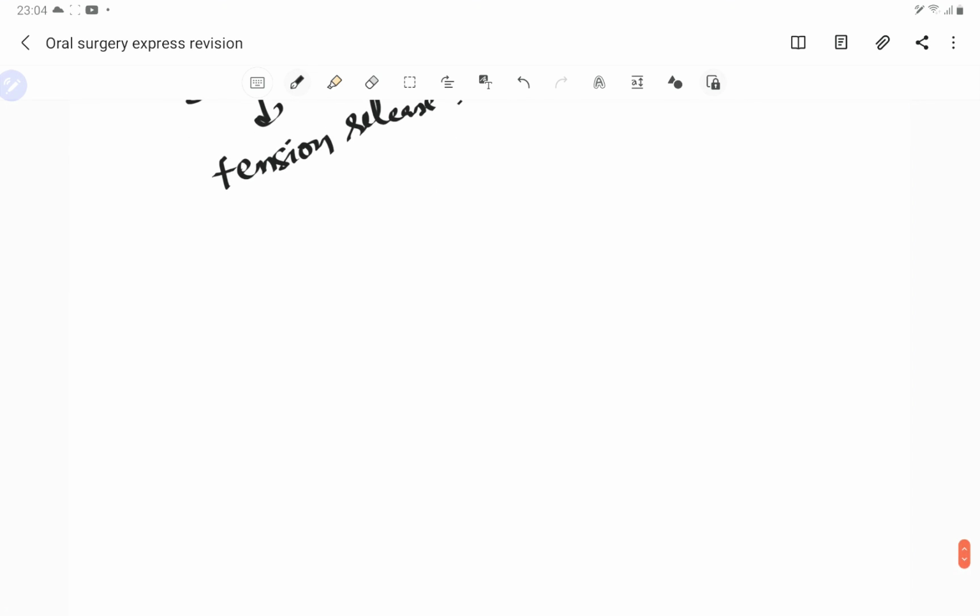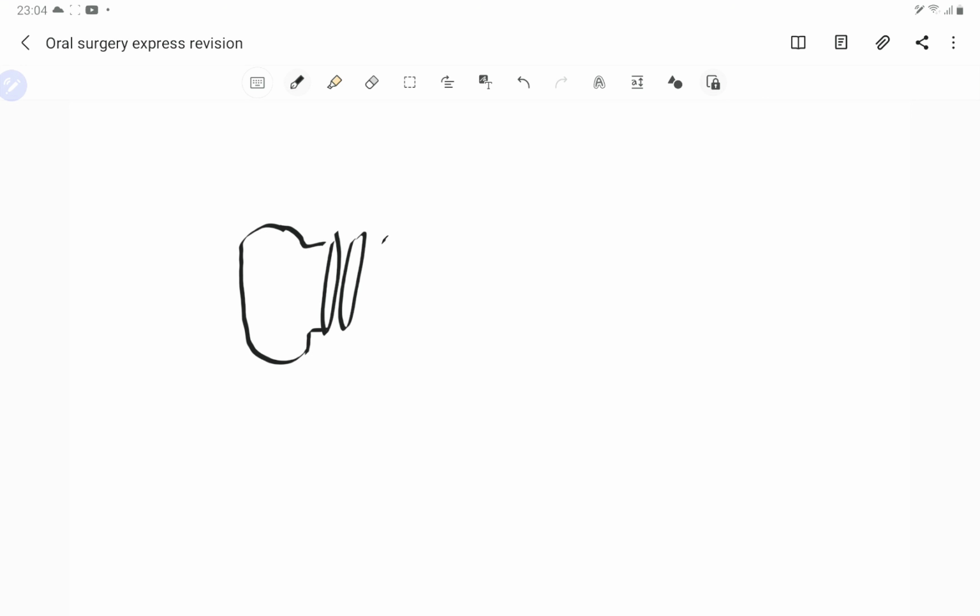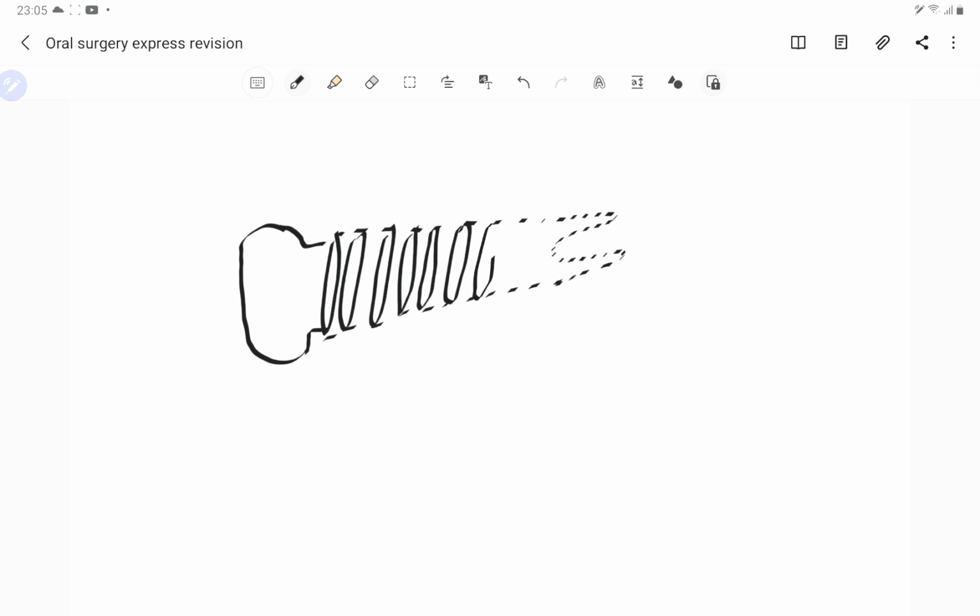This was about the principles of plate fixation. Now talking about the screw. Say suppose this is the screw head, then we have these threads. Basically this screw is like the screw which we use in implants, or the screws we use in the wall, it looks like that.